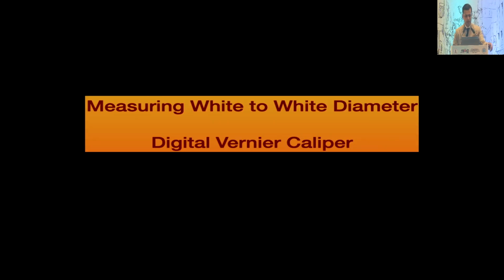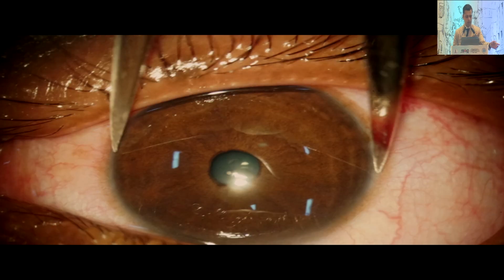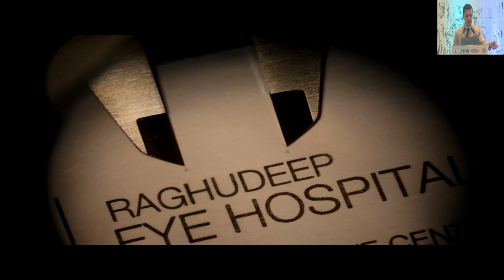Again, measuring white to white, Dr. Partha has discussed very well, so I'm not going to discuss, except for the fact that I don't like to use bulky instruments in the eye. So I use these old calipers, and once I have measured the white to white, I make a punch on a paper, then I use the digital calipers to measure it, so that I don't put that bulky instrument on the patient's eye. It tends to scare them, while the age-old calipers that we were using for extracapsular are very fine and the patient doesn't see them in their visual field, so you can do it very quietly without scaring the patient away.